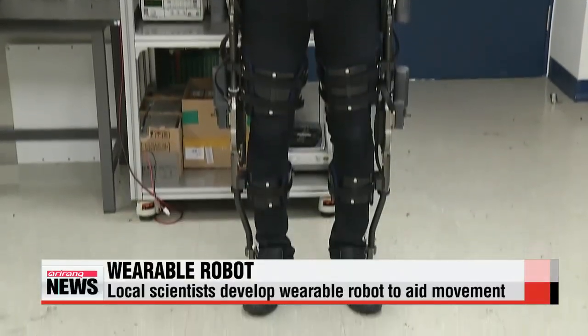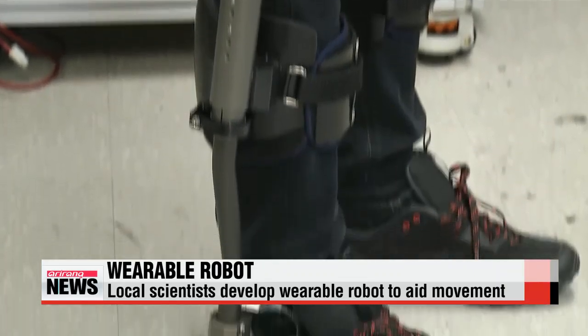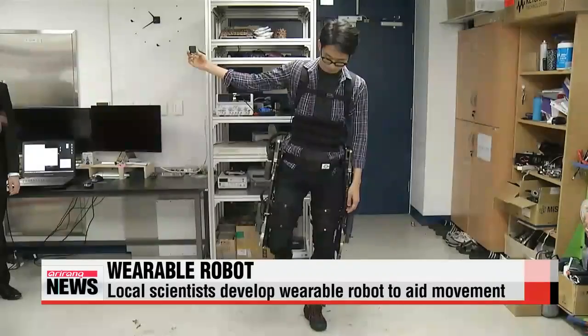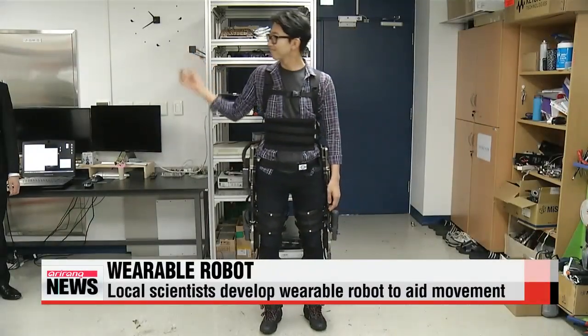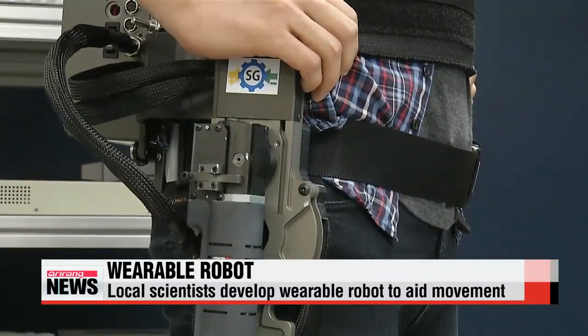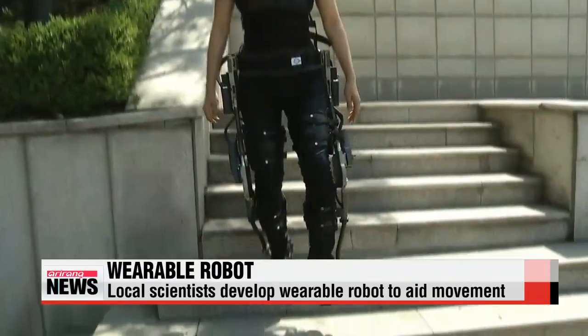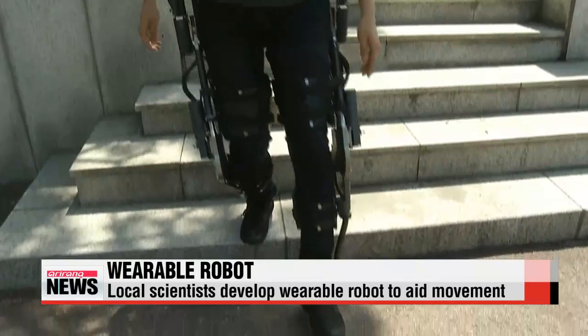This wearable robot can make your legs stronger and faster. Developed by a team of scientists at Seoul's Seogang University, the robot's 25 sensors measure how your legs are working, and then activate motors to aid their movement. For example, some sensors analyze foot pressure so the robot can determine how much to supplement the user's natural walking ability.